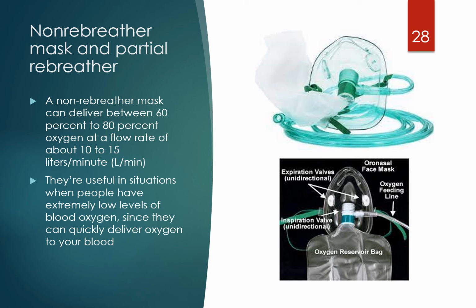And I wanted to show you these two little ports. You see these two little ports right here? These are little one-way valve adapters, right? So when they are on the mask, this is considered a non-rebreather. If you want to make this a partial rebreather, all you've got to do is remove one of those little plastic inserts, and what happens is you could entrain air. Obviously, a non-rebreather delivers higher levels of FiO2 than a partial non-rebreather.